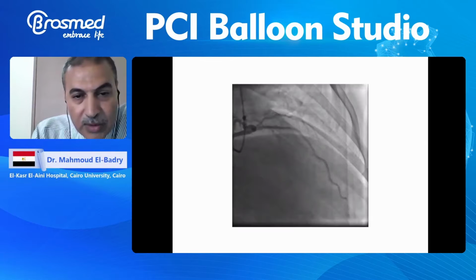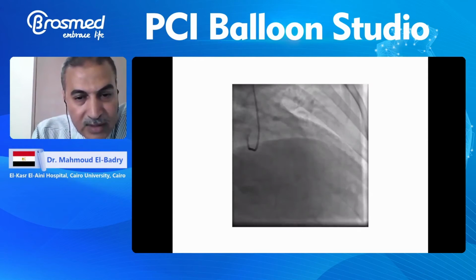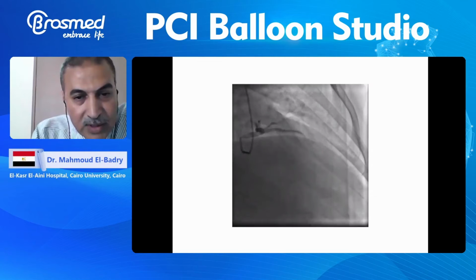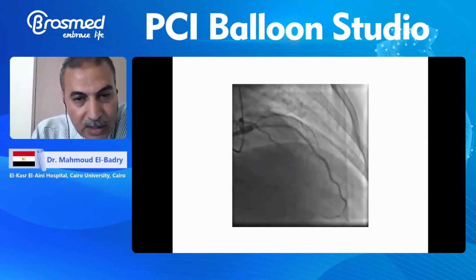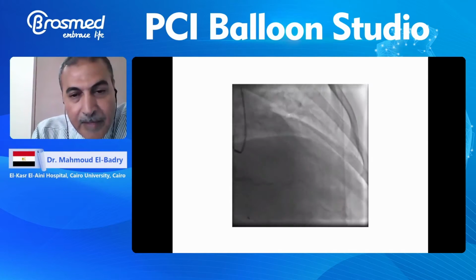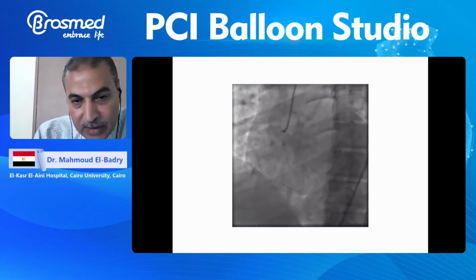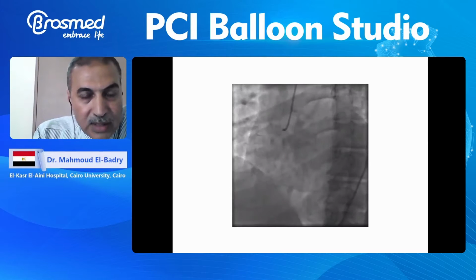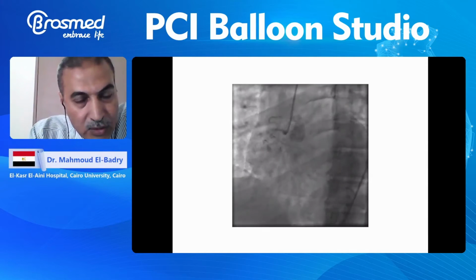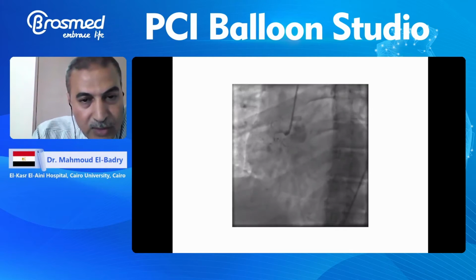So we don't know the onset of this occlusion of the right coronary, whether it is a year ago when he started to complain. Here is the total occlusion of the right coronary artery, proximal total occlusion with, I think, JCTO score 2.